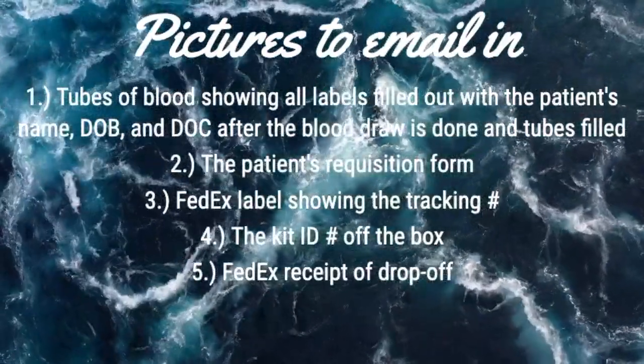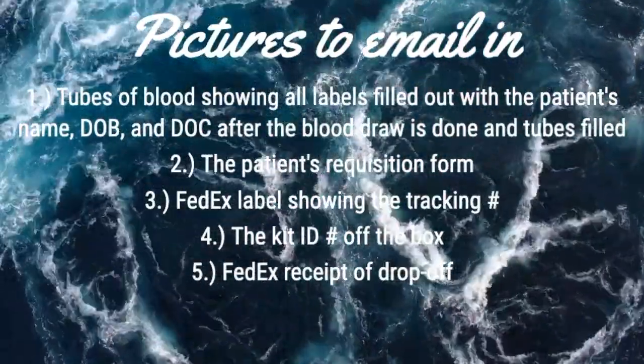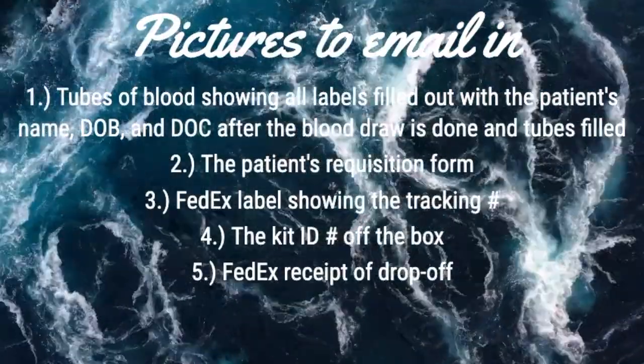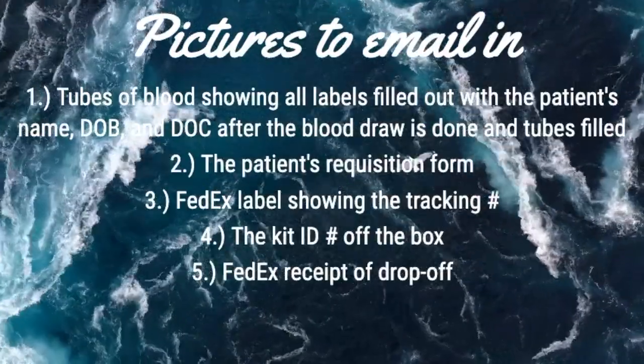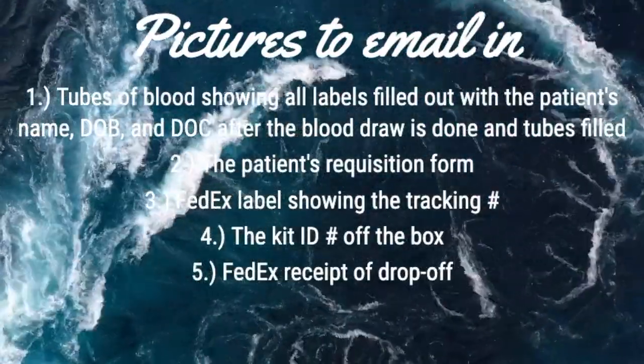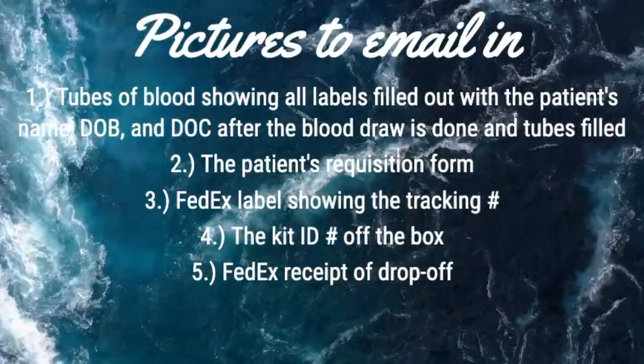If the FedEx facility doesn't give you a receipt upon drop-off, that is okay. All we need from you in your email is to mention the address of the location you dropped it off to, along with the date and time you were in the store dropping it off, in case there is an inquiry on the location of the specimen in the future.